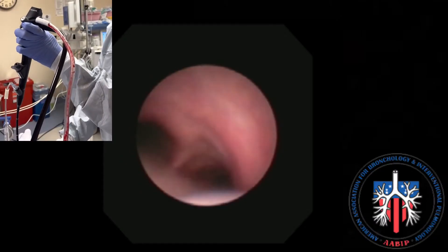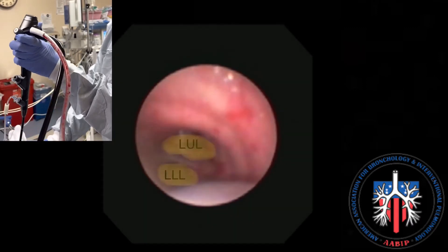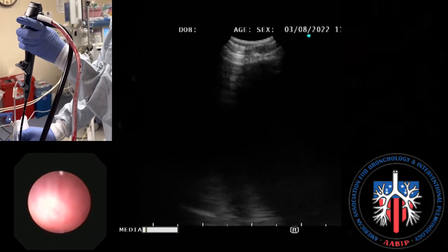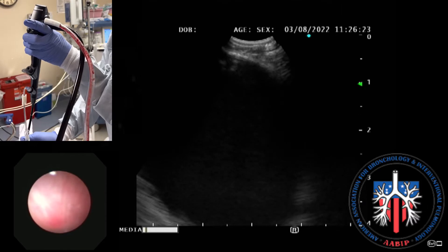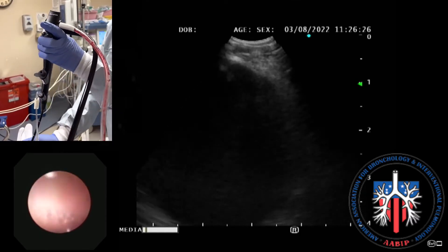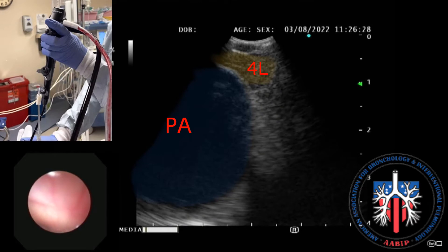Station 4L can be identified by advancing the EBUS scope into the left main stem bronchus and visualizing the left upper lobe and left lower lobe. The scope would then be flexed to identify the left main pulmonary artery. Station 4L is located between the superior border of the left main pulmonary artery distally and the superior border of the aortic arch proximally.